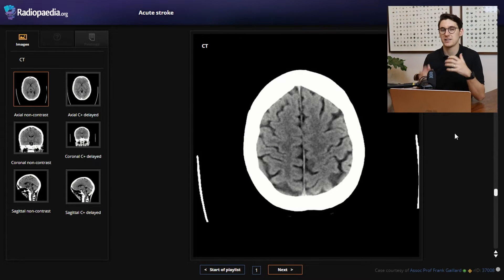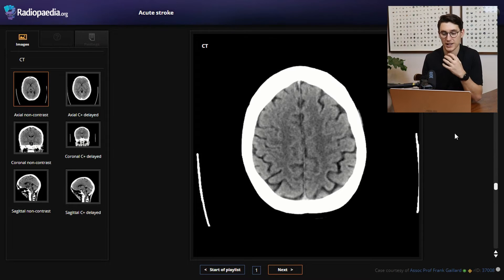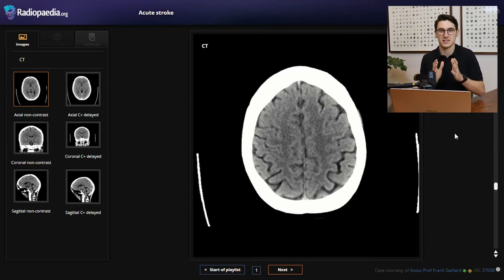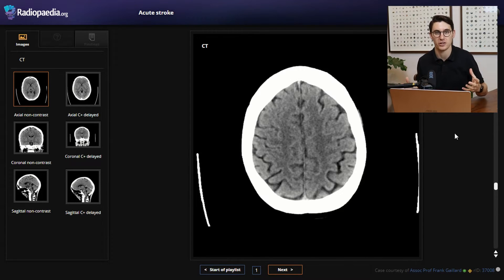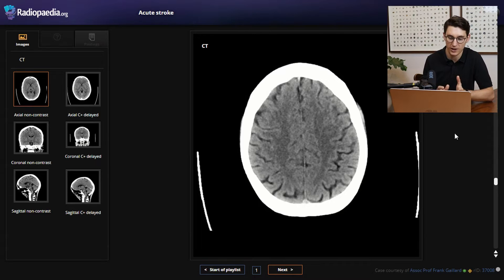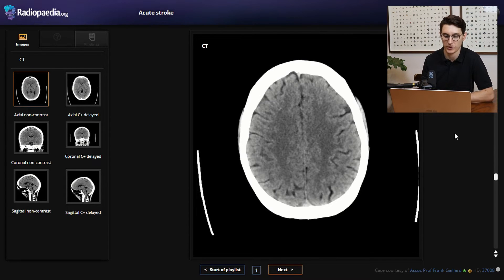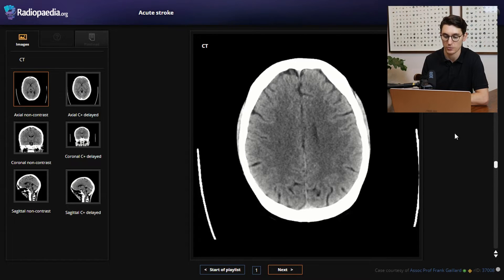We're going to go over the vascular territories of the brain. What I like to do is look at the specific vascular territories one at a time: the anterior cerebral territory, the middle cerebral artery, the posterior cerebral artery, and the cerebellar arteries. Just make sure that gray-white differentiation is apparent throughout the brain, because when we start to lose that differentiation, that's something that could be due to a thromboembolic event.